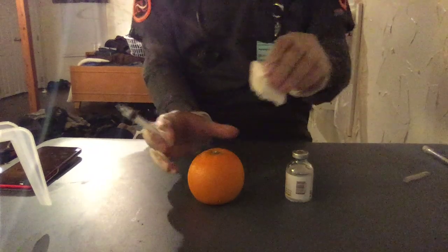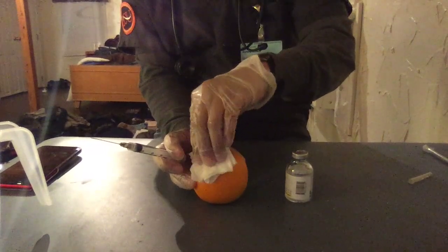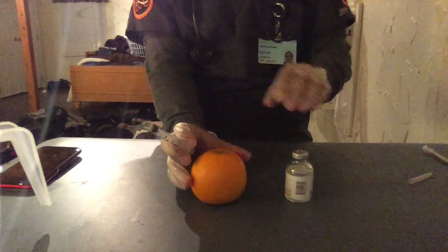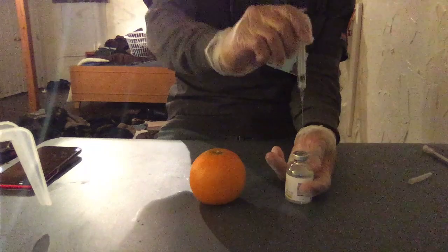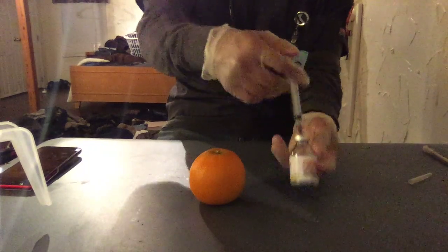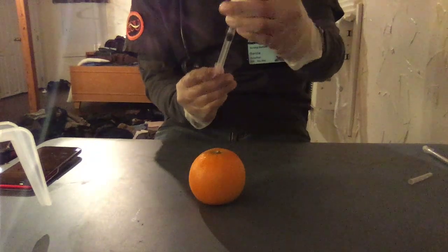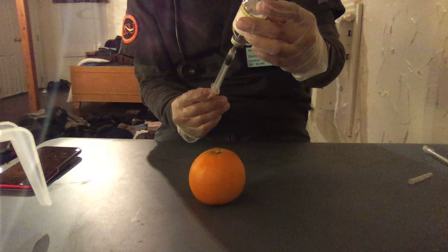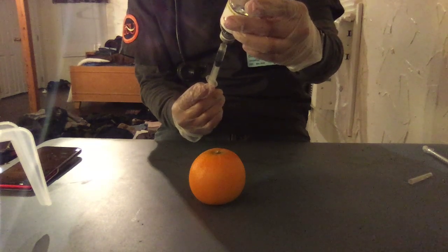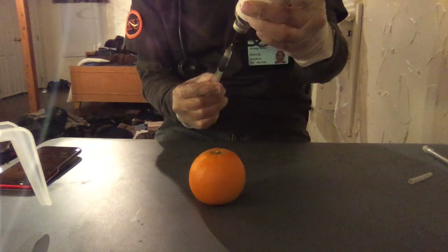I will clean her for 3 to 5 seconds, about 2 inches, just to get rid of all the germs that are right there. And I will put my needle in my vial, and then I will turn it, and then making sure that I have no air bubbles, I will draw up 1.5 milliliters of saline. Okay.